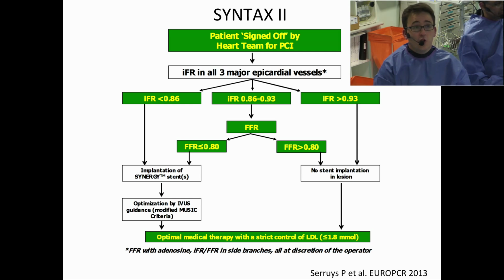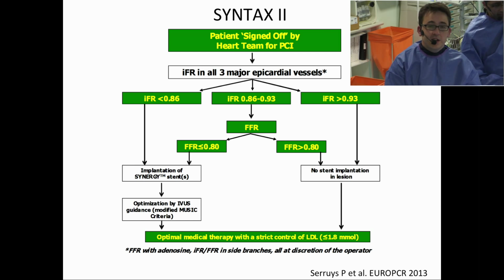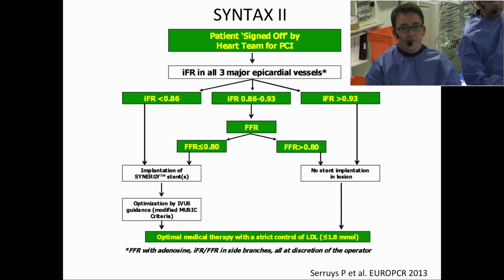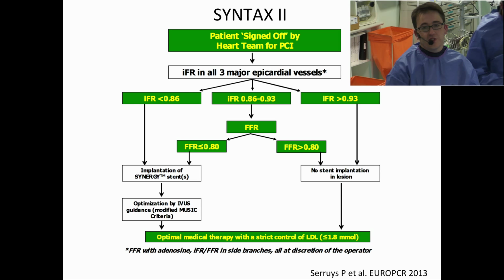And so it's not just these studies which are looking at this. We also are using these techniques in the SYNTAX II study. So this is a study led by Javier Escaned and Adrian Banning, and the chairman here is Patrick Serruys. Very similar to the SYNTAX I study, but there's one key difference, is that we're using physiology, so this so-called hybrid iFR-FFR strategy, to diagnose which lesions are in need of treatment, getting modern drug-eluting stents, and then IVUS optimization. And this study has been surprising all of us. We often get cases of 3-vessel disease, which we put pressure wires down, and we frequently overturn the angiographic decisions. And these patients would, of course, routinely be sent to surgery and now just having a single stent in the LAD, and that's really it for them.